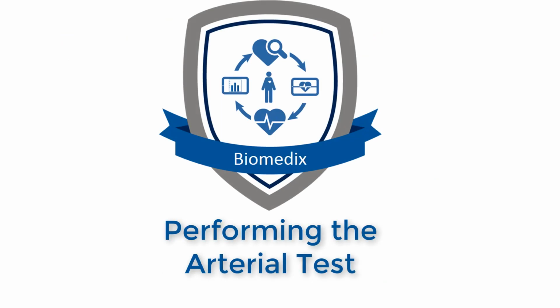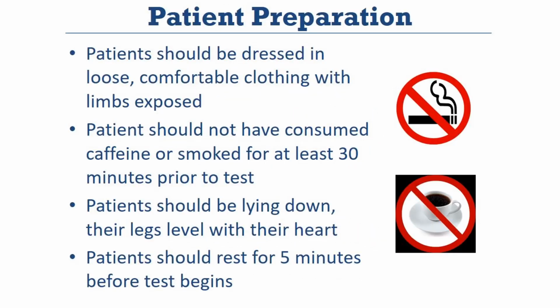In this section, we'll discuss performing the arterial test. We'll discuss patient preparation strategies, taking blood pressures, and capturing pulse volume recording waveforms, or PVRs. Patients should present for the study in loose, comfortable clothes with their arms and legs bare.